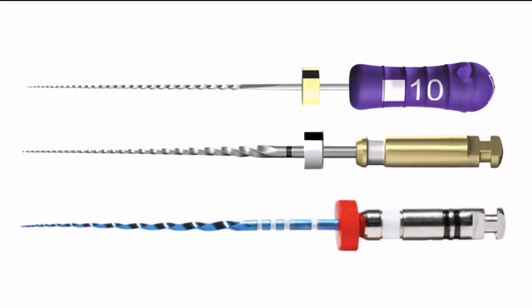But most of the cases that we're treating in our practice are shaped way more conservatively than they were in the past. And for the bulk of my cases, I'm using a ProGlider instrument to create the bulk of my shape, and sometimes I'll blend it with a little bit of a 15/04. Maybe I'll go up to a 20/04. That's the adjustment I made in my own personal shaping. And the case results have been really impressive and quite rewarding.